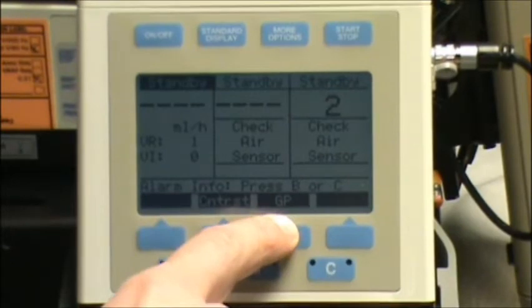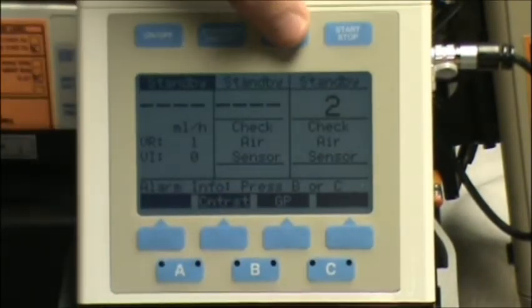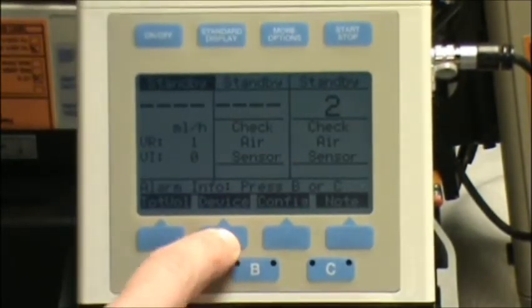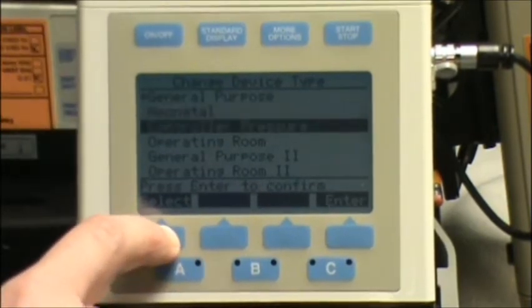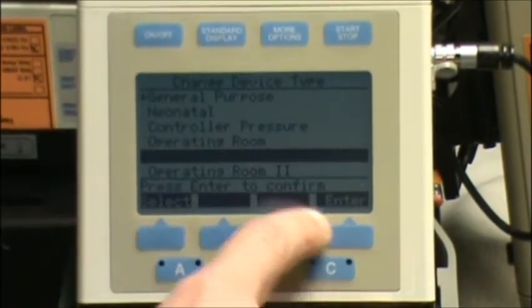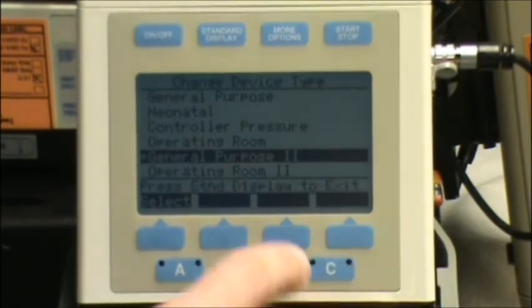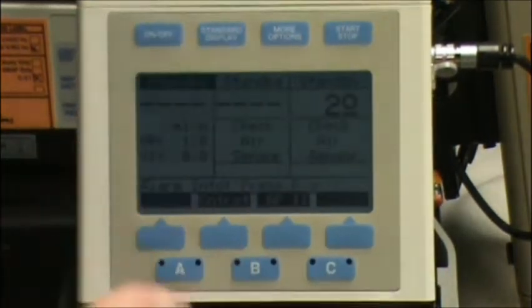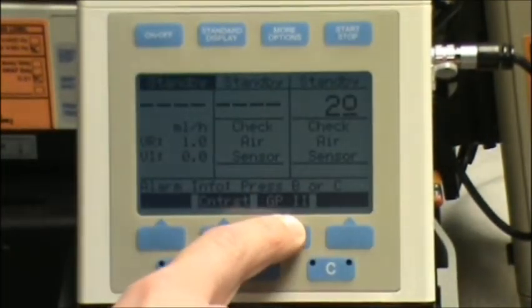I'll notice this is in GP right now. So I'll go to more options, device, select, press enter for GP2, and back to standard display and I'll notice I'm in GP2 now.